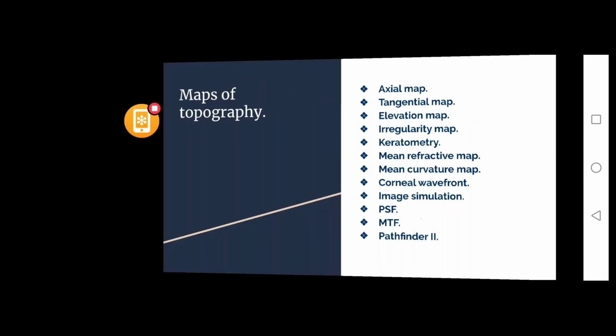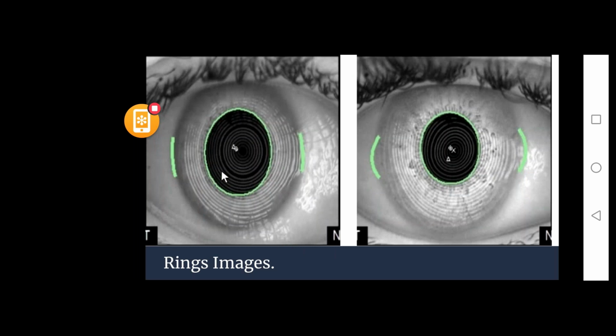All right. So please confirm whether the rings images are visible on the screen or not. Yes, sir. It's visible, sir.